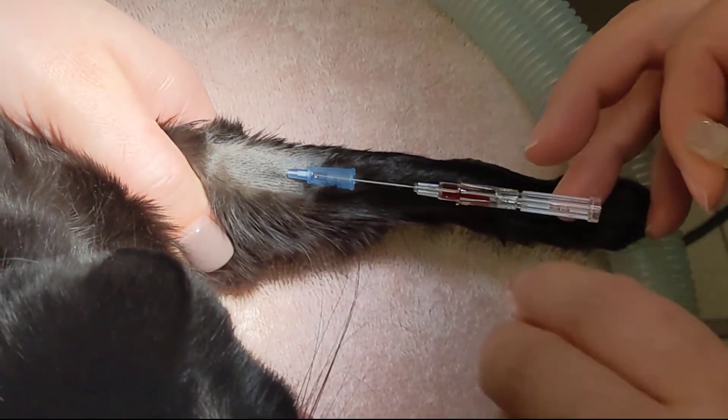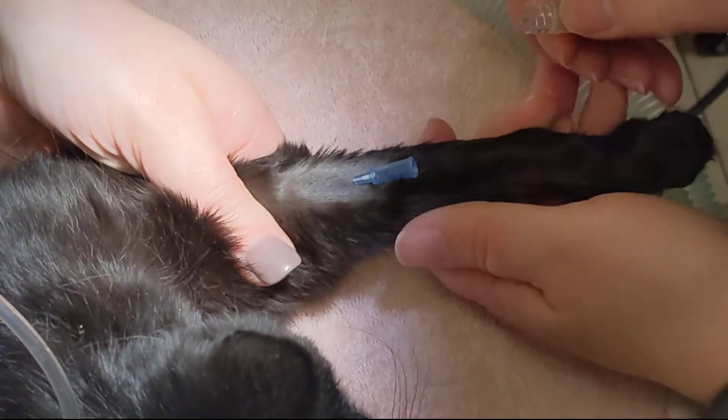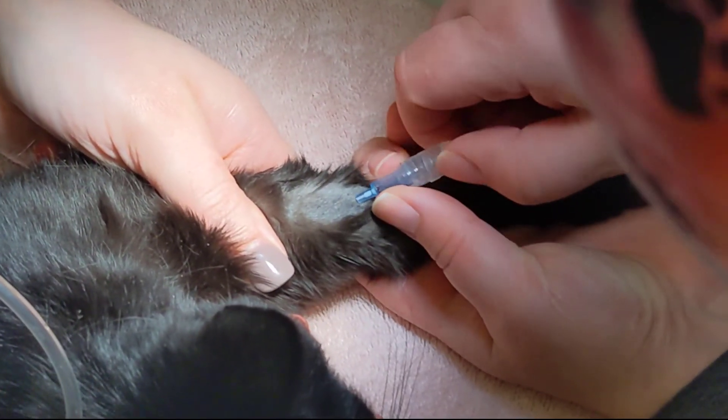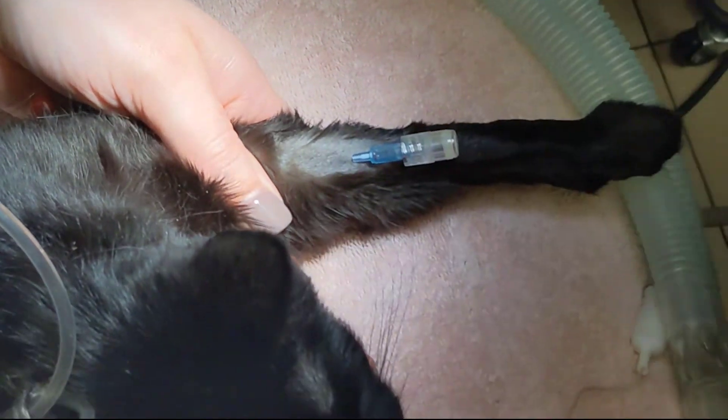There are several reasons this may have happened. The animal's blood pressure may be low, the catheter may be burred, damaged, or compromised in some way, or the catheter may not actually be inside the vein.